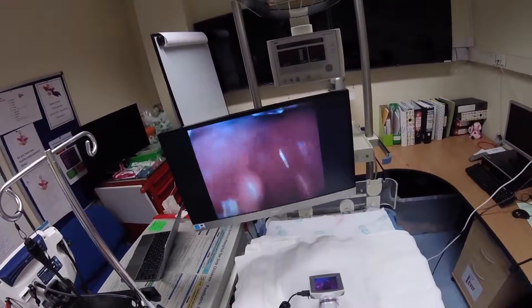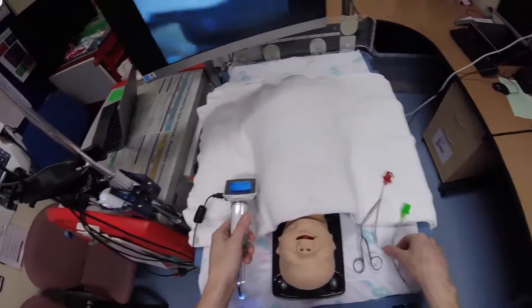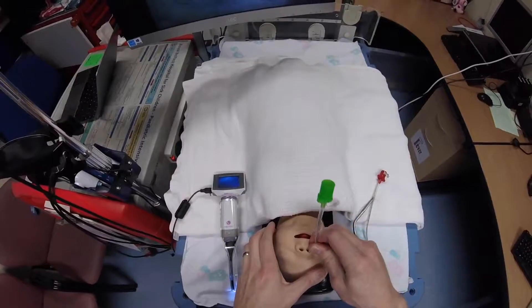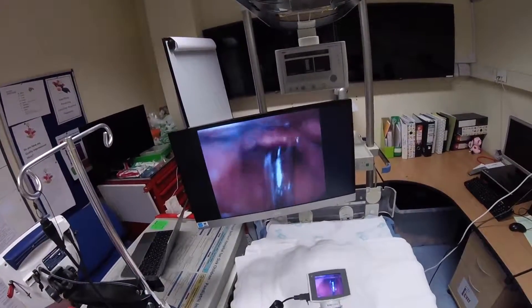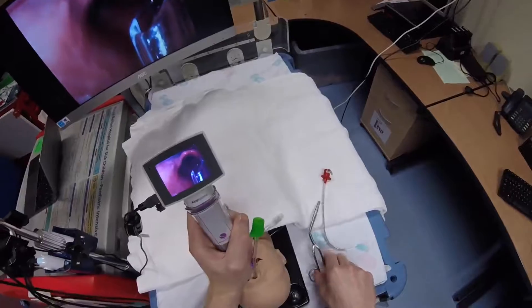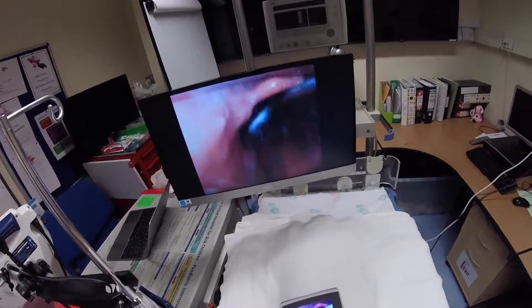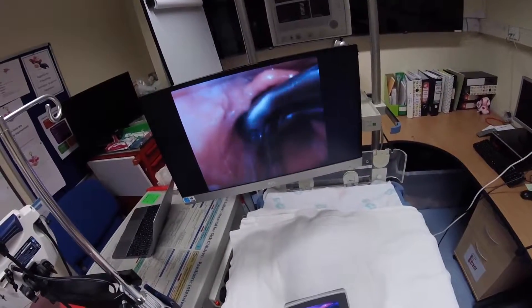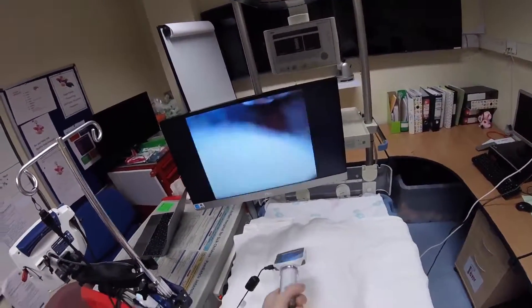Starting with the paediatric video adapter and a size one un-channeled A-Blade in the Peri-Raban baby, oral intubation is fairly straightforward. Moving to nasal intubation, and again, no difficulties with that.